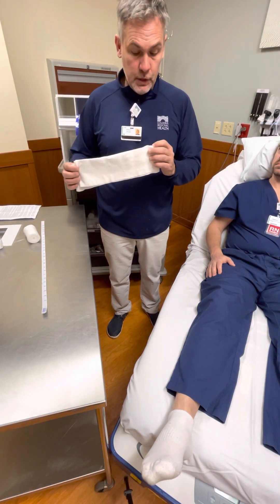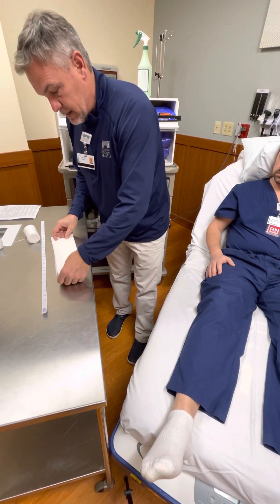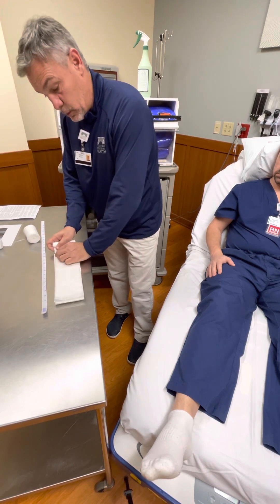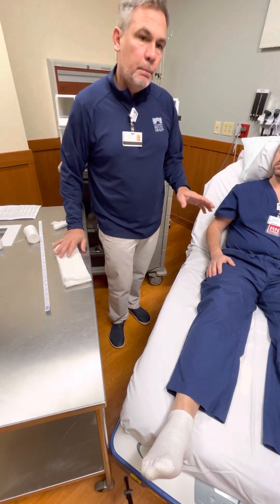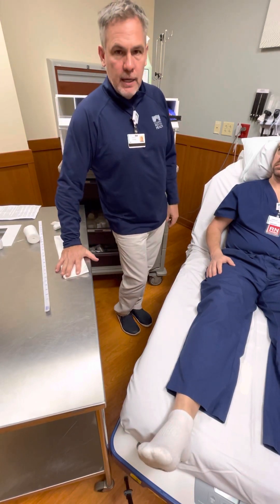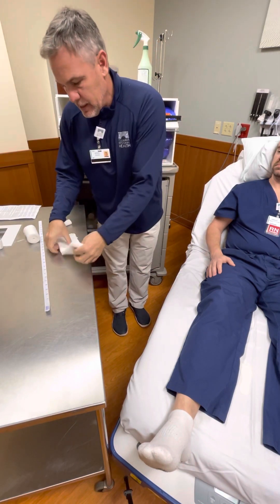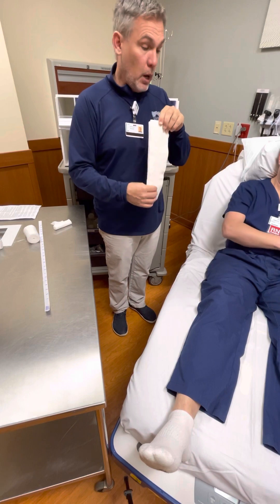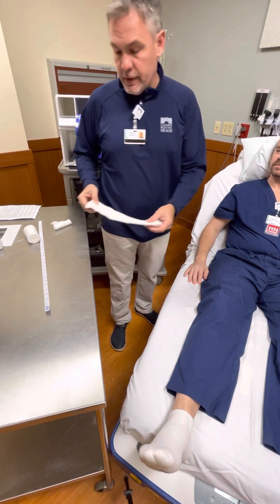It is extremely important that we make sure we cover all bony prominences and cover the skin. I put at least 10 layers of these on. Going over a bony prominence - one, two, three, four, five, six, seven, eight, nine, ten. You don't have to cut this - it just rips and you fold it back on top. I have 10 layers, which is where the casting material will go on top of. You can actually put too much - if 10 is good, don't think 20 is better with a big fat pad underneath. That's plenty thick to take care of any bony prominences and protect against the hardening of that ortho glass.